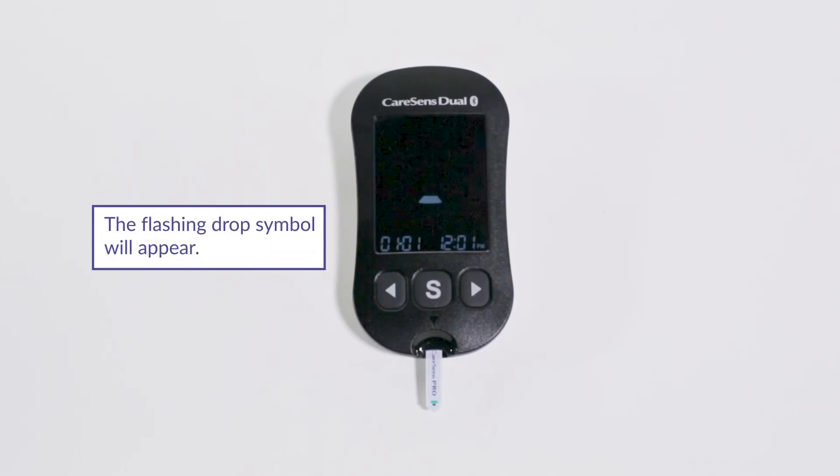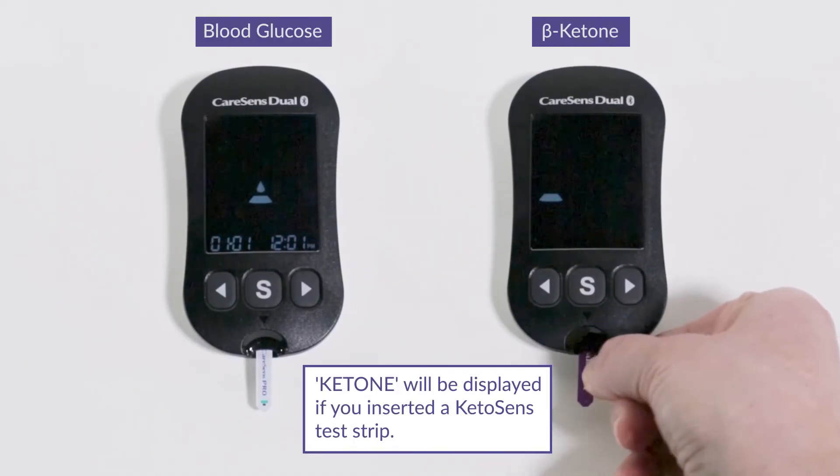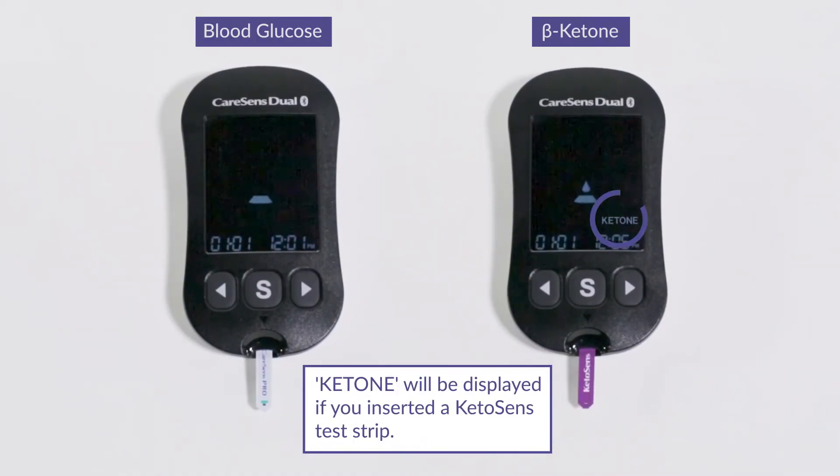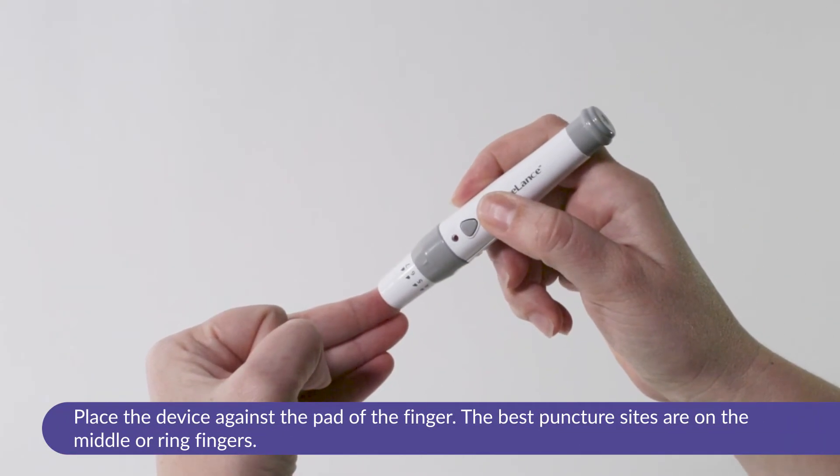The flashing drop symbol will appear on the screen. Ketone will be displayed if you inserted a KetoSENS test strip. Place the device against the pad of the finger. The best puncture sites are on the middle or ring fingers.